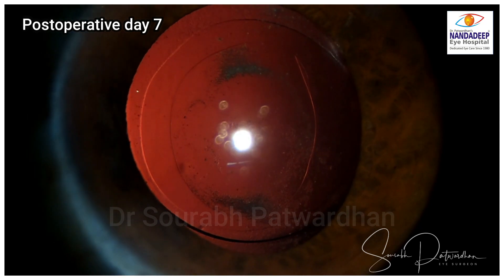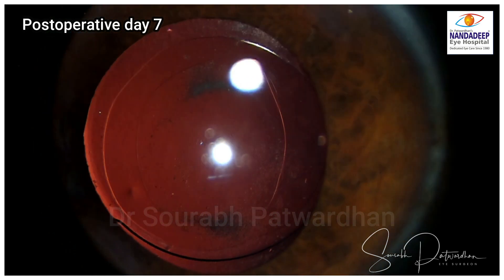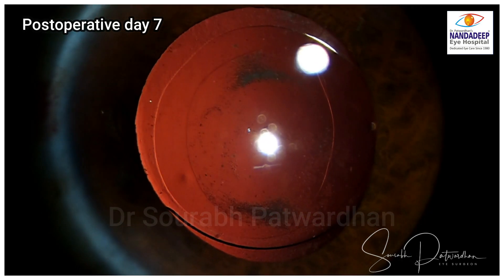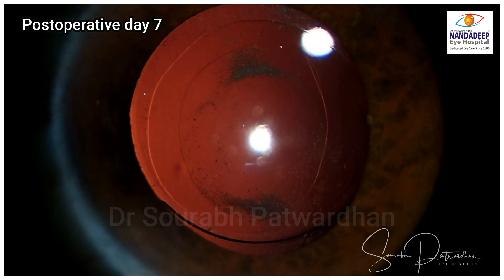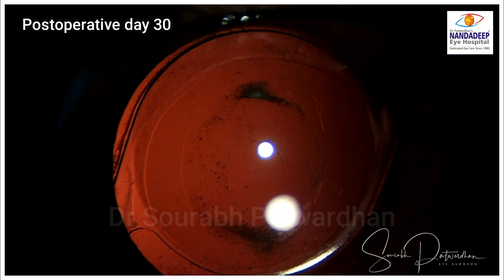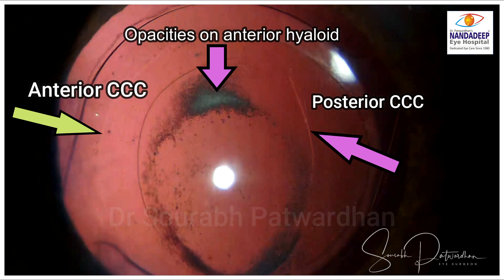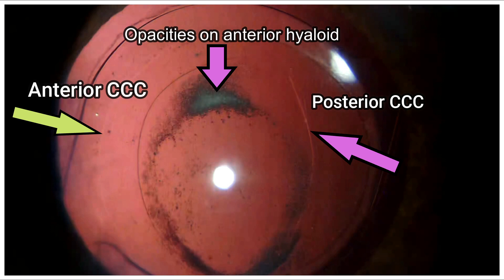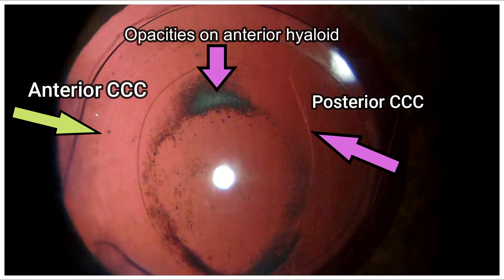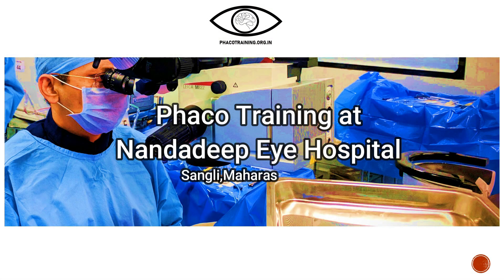If the opacities cause any visual problems, we can always do YAG laser after two to three months. At day 30 you can see the opacities are now getting smaller and smaller, getting further absorbed. You can see the anterior CCC margin, opacities of the anterior hyaloid, and the nicely done posterior capsular rhexis.